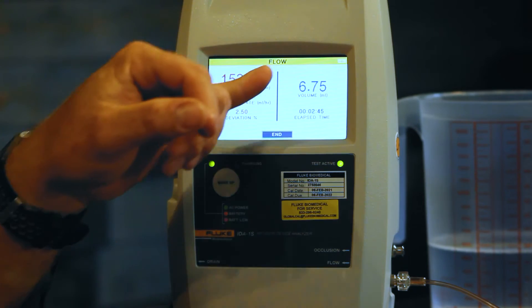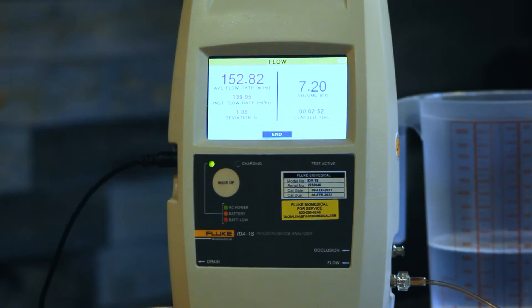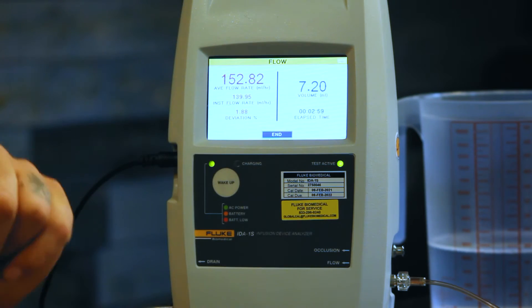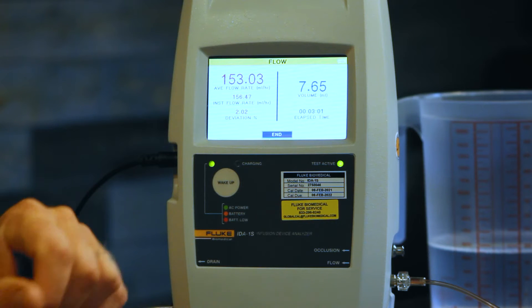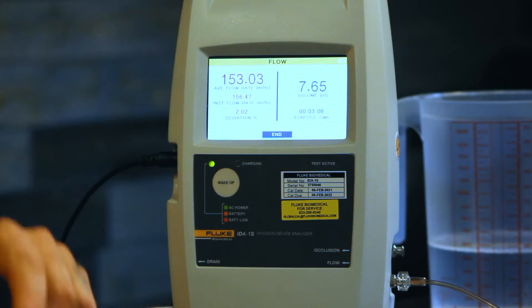We're back — we are about two minutes and 42 seconds into our test. So far we have flowed 6.75 milliliters, and over here it says 7.2 milliliters. So really close — this is a great way to check your test information as you're going. We have our average flow rate of 152.82 milliliters per hour, our instant flow rate of 156, and 2.02 percent deviation. We're going to let this test complete and then move over to our occlusion pressure test.